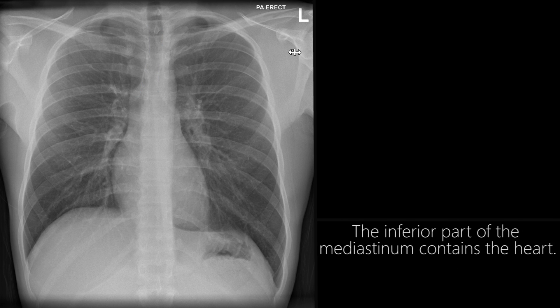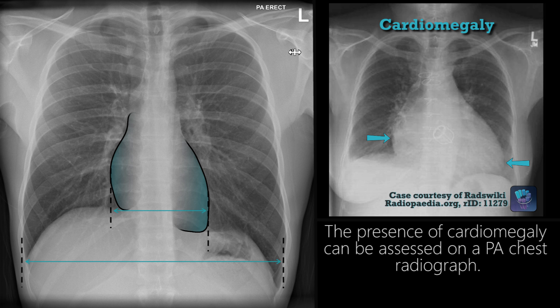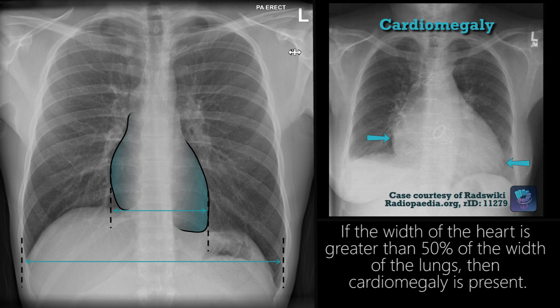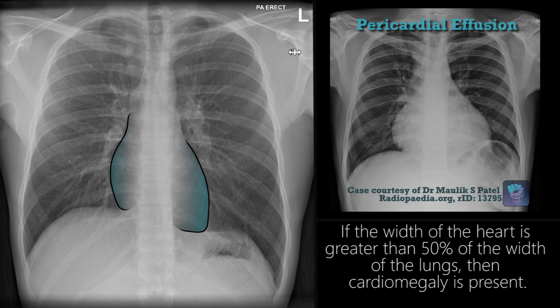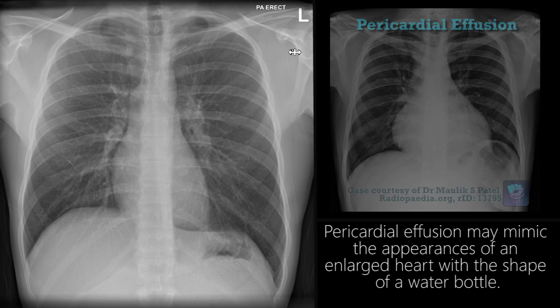The inferior part of the mediastinum contains the heart. On the right, the border is formed by the right atrium, whilst the left border is formed by the left ventricle. The presence of cardiomegaly can be assessed on a PA radiograph. If the width of the heart is greater than 50% of the width of the lungs, then cardiomegaly is present. Pericardial effusion may mimic the appearance of an enlarged heart with the shape of a water bottle.